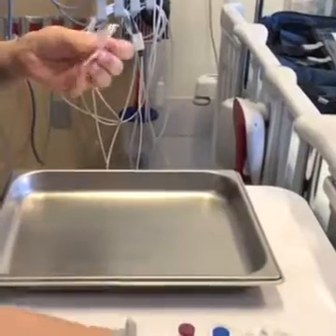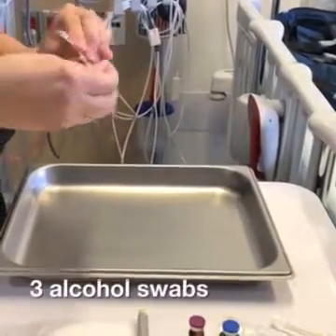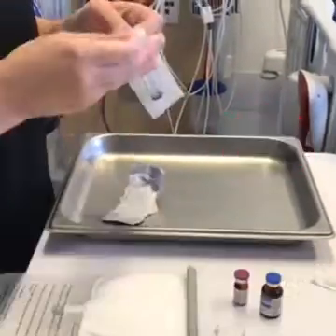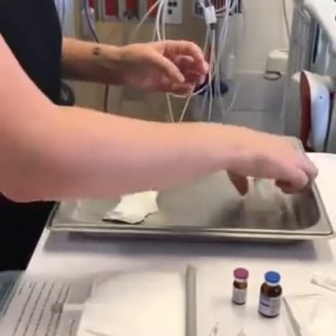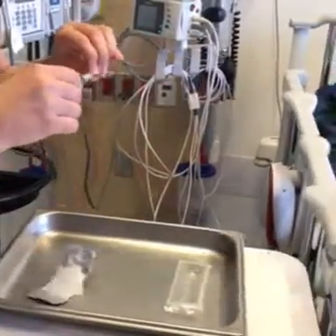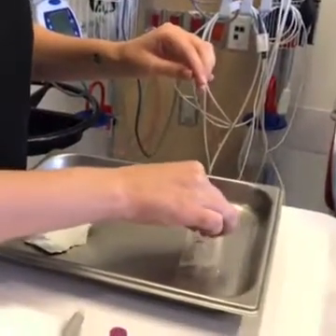If you'll be adding medications such as vitamins to your child's PN, gather those supplies now. You will need three alcohol swabs, a 5-milliliter syringe, and a one-inch needle. Attach the needle to the syringe, twist to connect, and be sure not to touch the sterile ends.